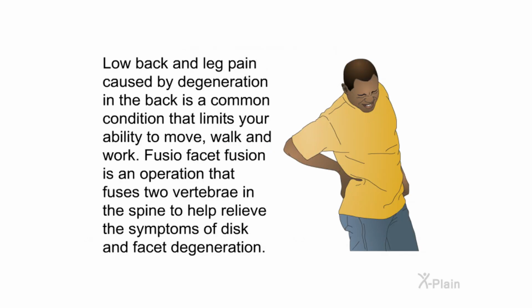Summary. Low back and leg pain caused by degeneration in the back is a common condition that limits your ability to move, walk, and work. Fusio Facet Fusion is an operation that fuses 2 vertebrae in the spine to help relieve the symptoms of disc and facet degeneration.